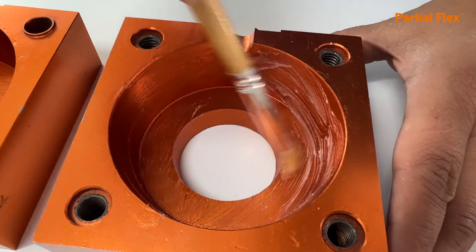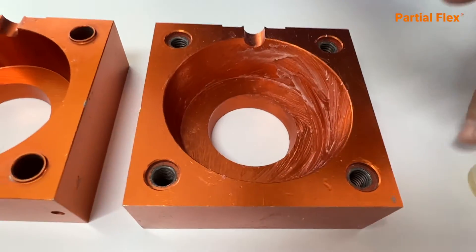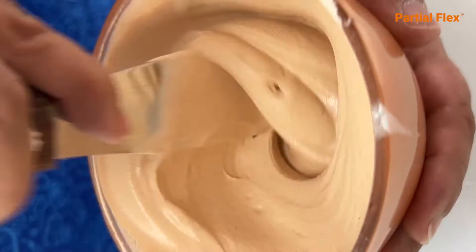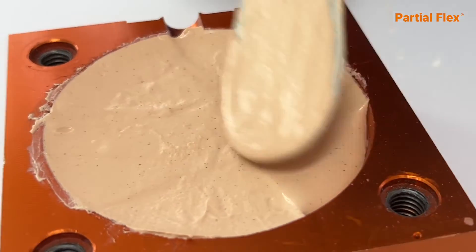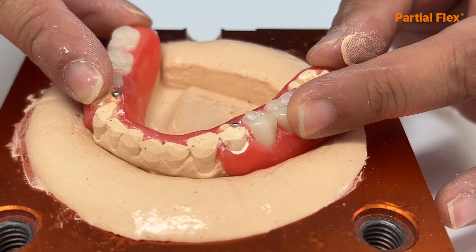Apply petrolatum over both sides of the partial flex flask. Mix 200 grams of partial flex type 4 plaster and pour into the flask. Immerse the model carefully into the plaster.